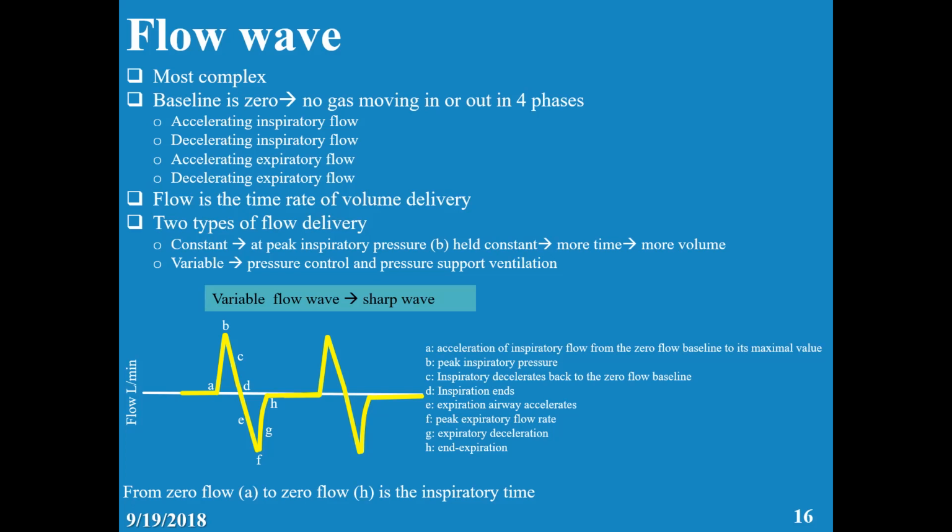Right now I've talked about overshoot, but I was only trying to show you the principle of the graphs. You will see the different types of graphics in different modes and in different complications, and how to solve them.